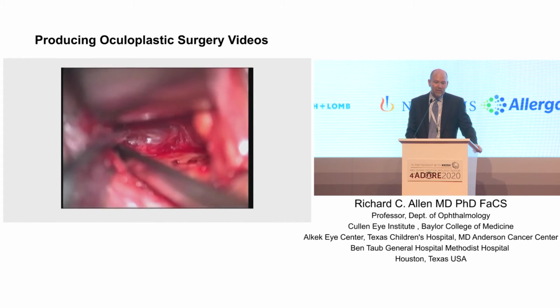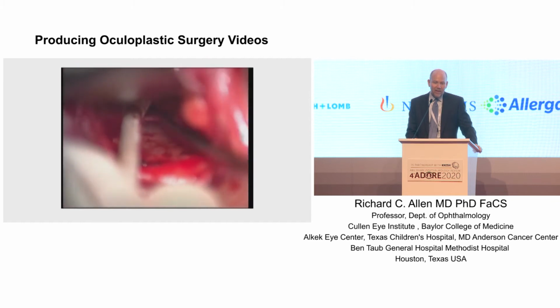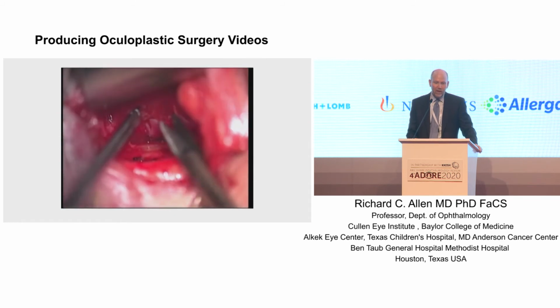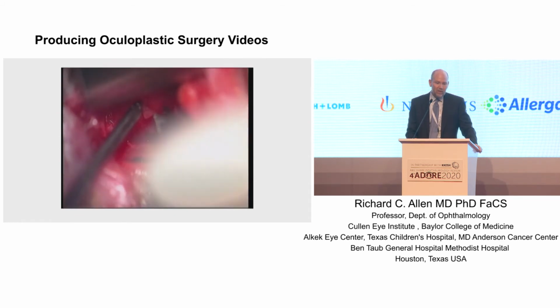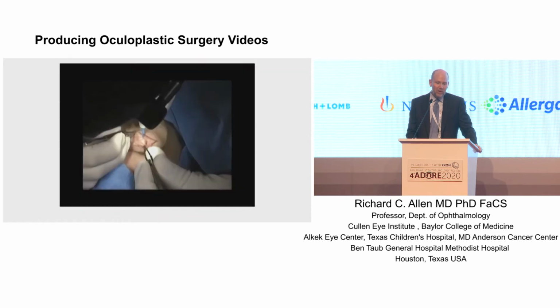But I'm not a big fan of using the microscope. I like to use loupes. And I gave up the microscope back in the days when I gave up cataract surgery. But in some instances, it's really nice to use, as in this instance. And also, if you want to video a particular type of surgery, it's nice to use.